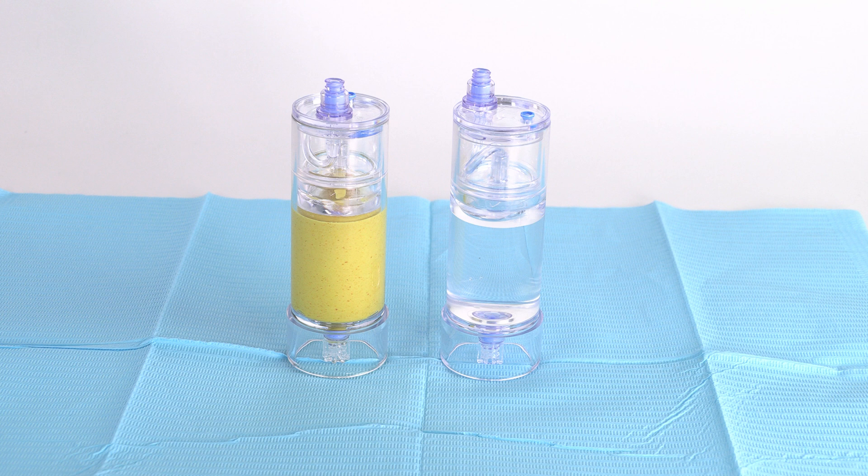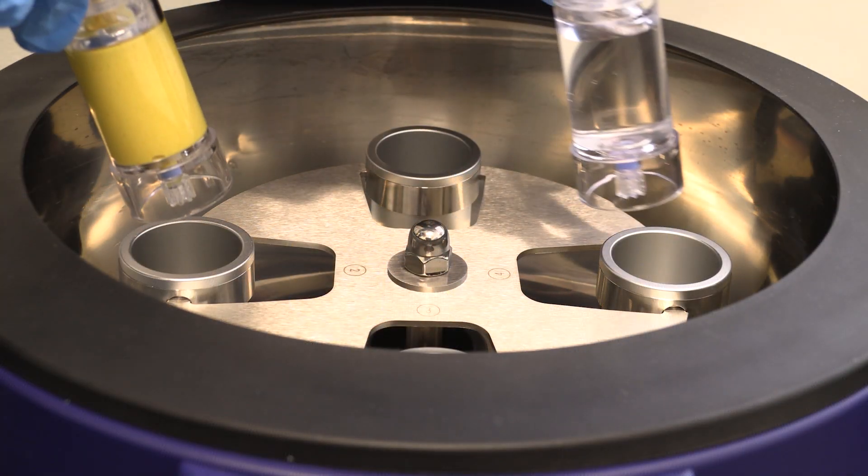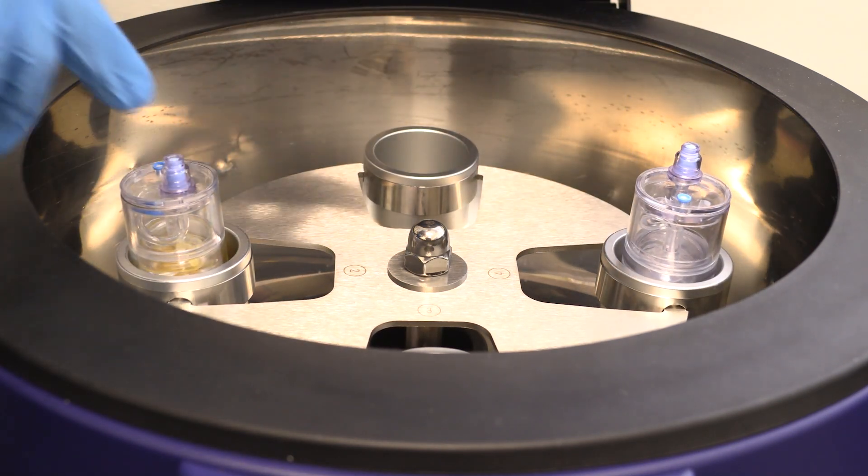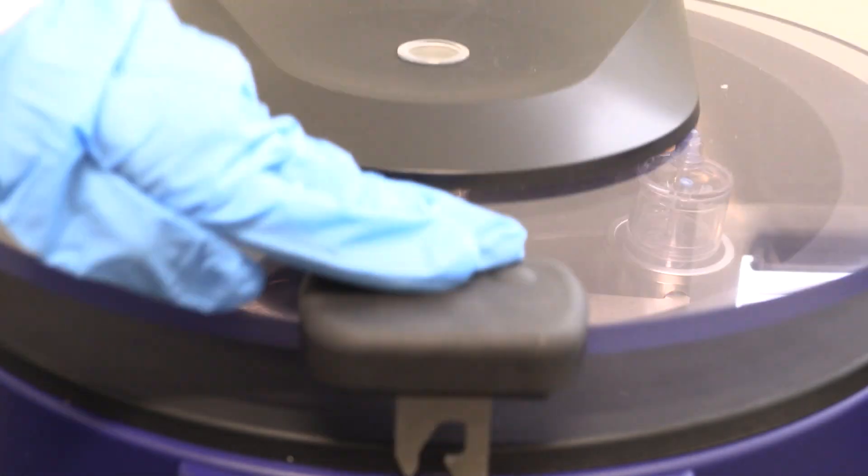Counterbalance the device and place them in the centrifuge buckets at opposite ends. Follow the protocol settings provided in the Progenikine IFU insert.